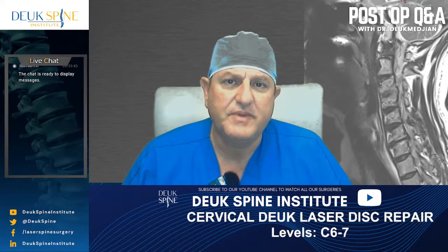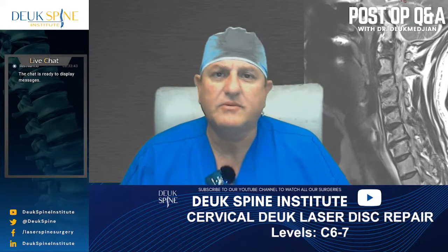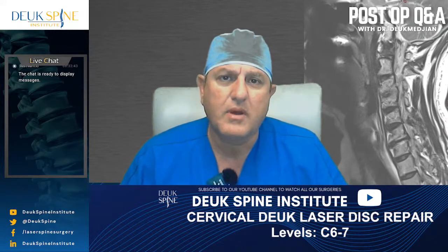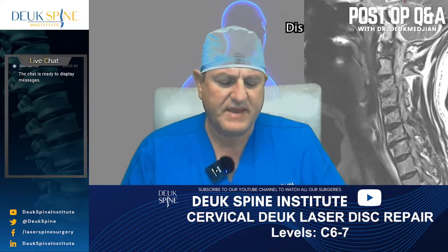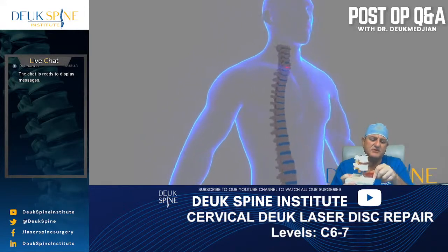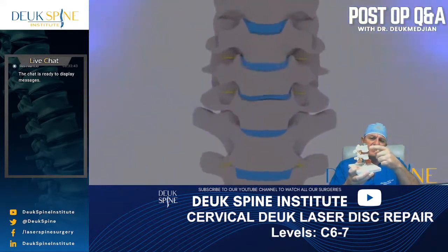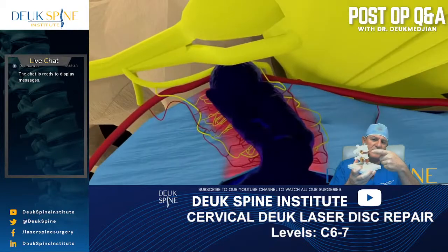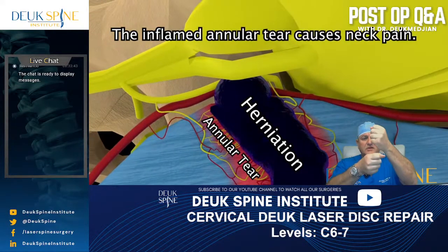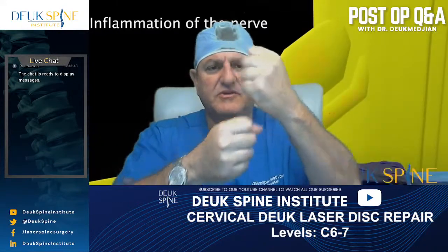The Deuk laser disc repair is an endoscopic type surgery where basically we go in with a tiny incision and use a little tube and an endoscope to find the problematic area in the back of the disc. And the problematic area in the back of the disc, if you want to understand the anatomy of the spine so you understand what a disc is, there are bones in your spine. Between these bones is a cushion because the bones actually move. And you don't want hard bones grinding on each other because they'll wear each other down over your lifetime.